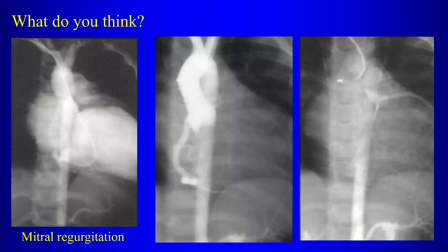Between the aorta and the pulmonary artery? A malignant origin? Why would that cause it to opacify later? Because it's impinged between them, no? Unless the origin is from the pulmonary artery.